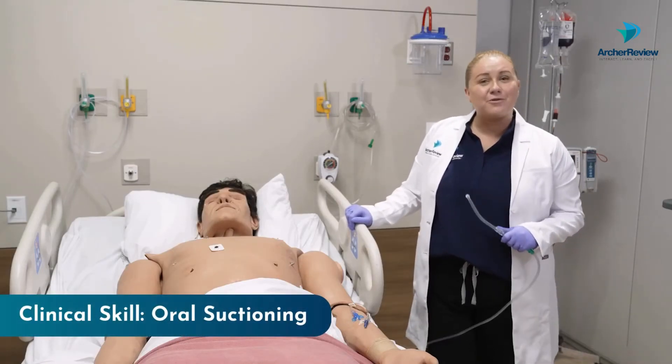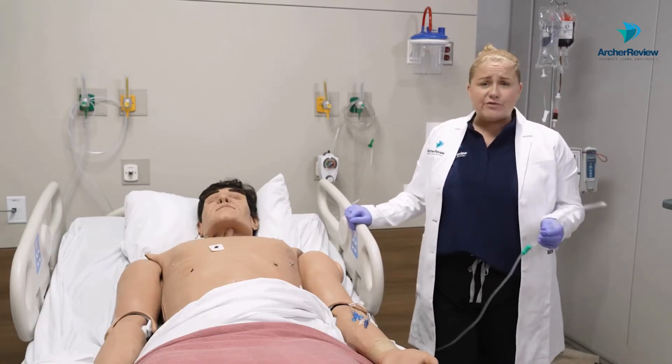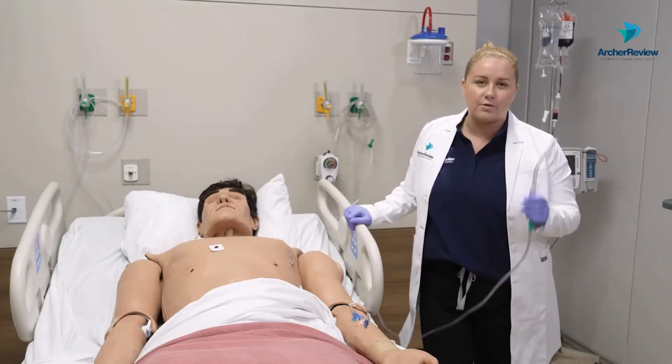Hey there everyone, Dr. Taylor back with Archer Review. Today let's look at oral suctioning. This is a straightforward skill, but it's something I guarantee you're going to do nearly every shift, so you really should know the equipment.